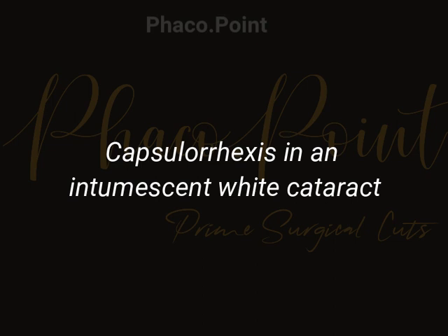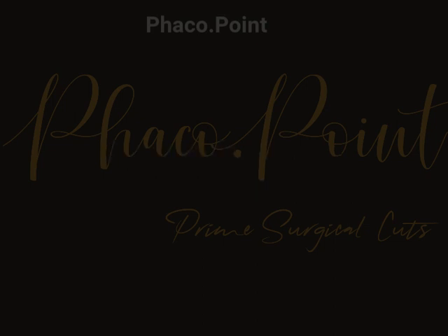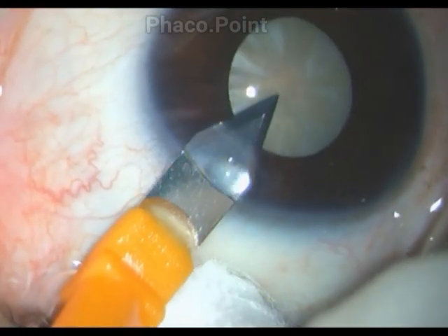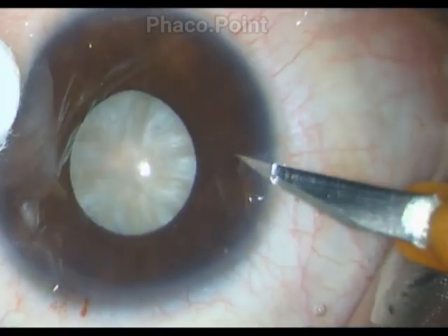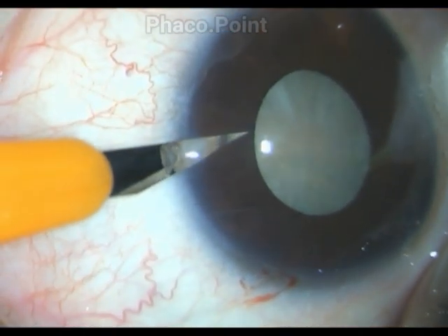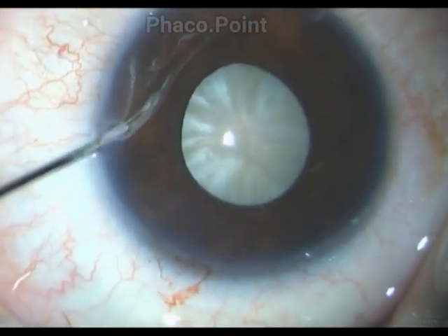This patient presents with an intumescent cataract and a small pupil. I'd like to demonstrate the technique of a capsular rhexis, which I find really works for me. You do know that your initial steps and incisions need to be bang on, because you don't want difficulty in instrumentation thereafter.